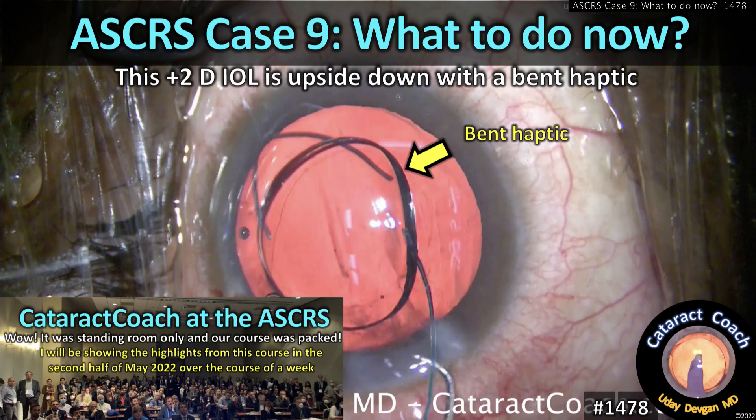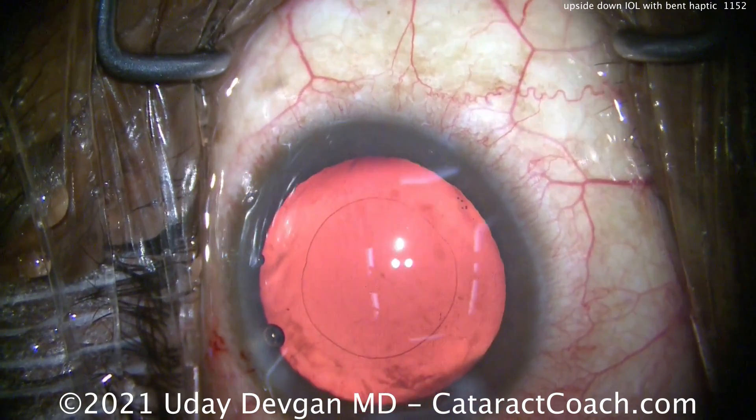CataractCoach.com, ASCRS case number 9 — what to do now? You've got an unusual IOL that goes in the eye upside down.